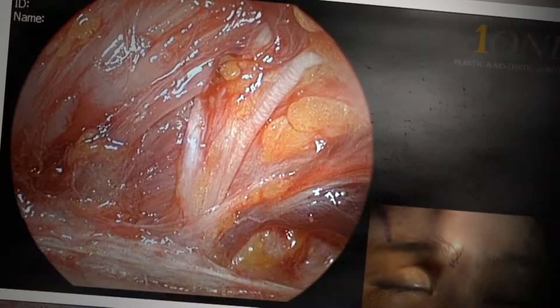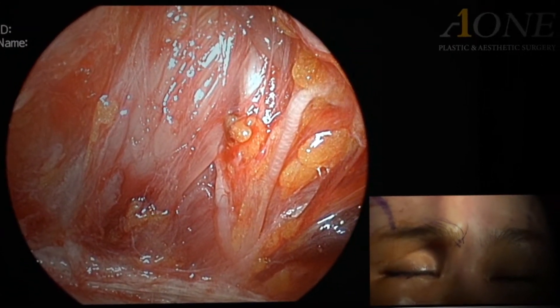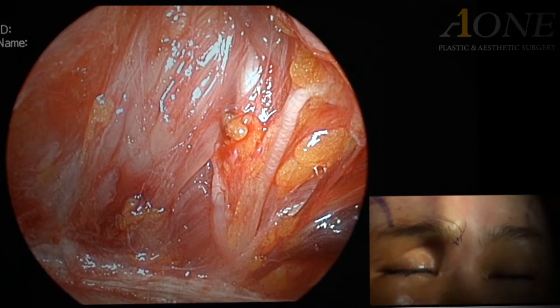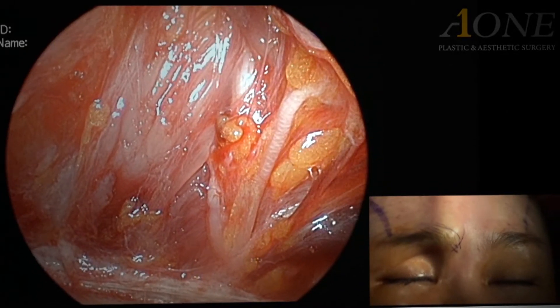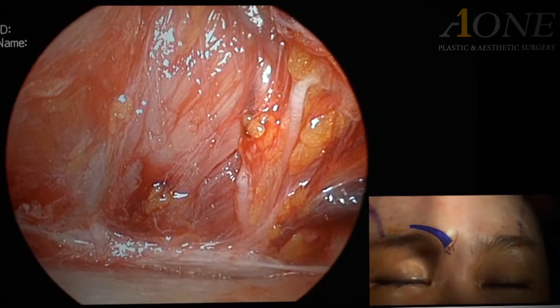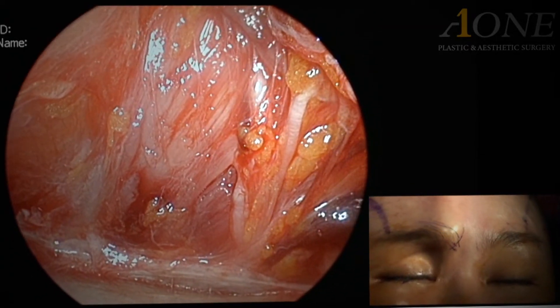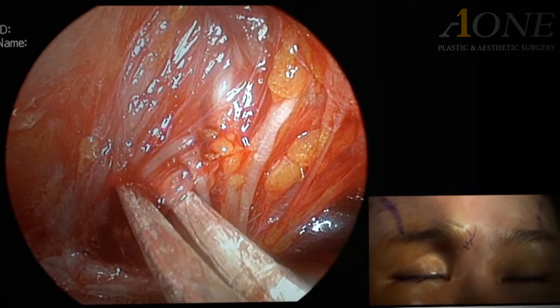In order to remove glabella wrinkles, the glabella muscle must be cut. First, the strongest corrugator superciliae muscle fiber must be incised. The muscle you see here is the corrugator superciliae. This muscle's repetitive contraction creates glabella wrinkles — it is the glabella wrinkles' main culprit.